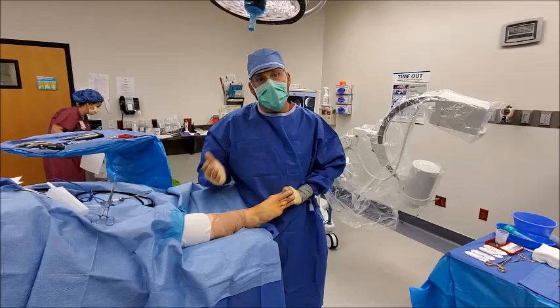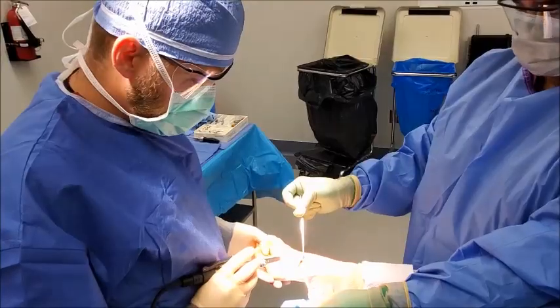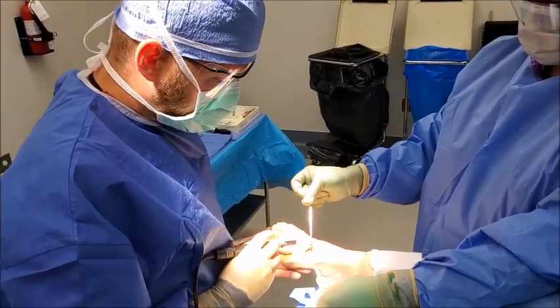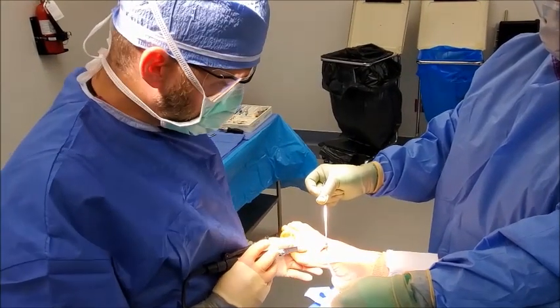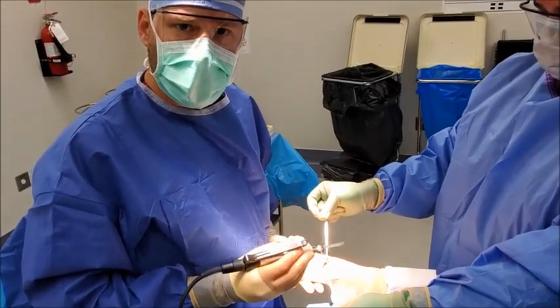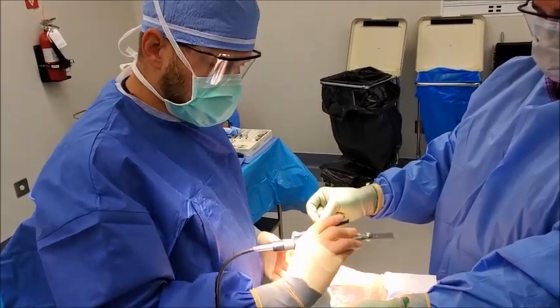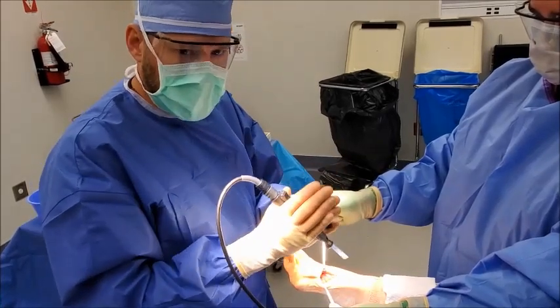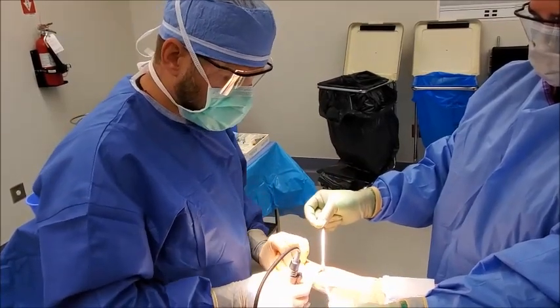We create about a three-and-a-half centimeter incision here, exposing what we call the first tarsometatarsal joint, or TMT joint. The next step is one of the most important parts of lapoplasty versus traditional bunion surgery: we use a special saw blade to plane the joint, making that joint surface flatter so we can rotate the first metatarsal.